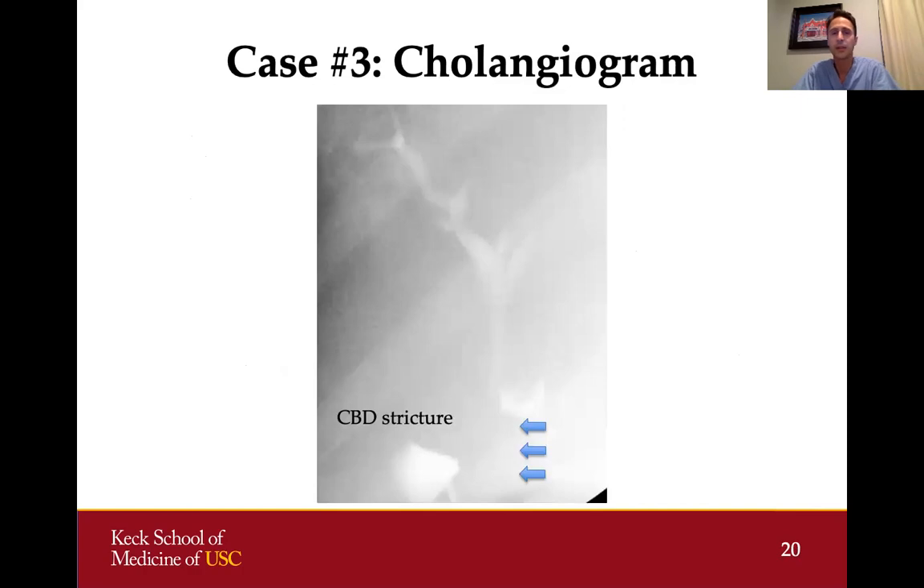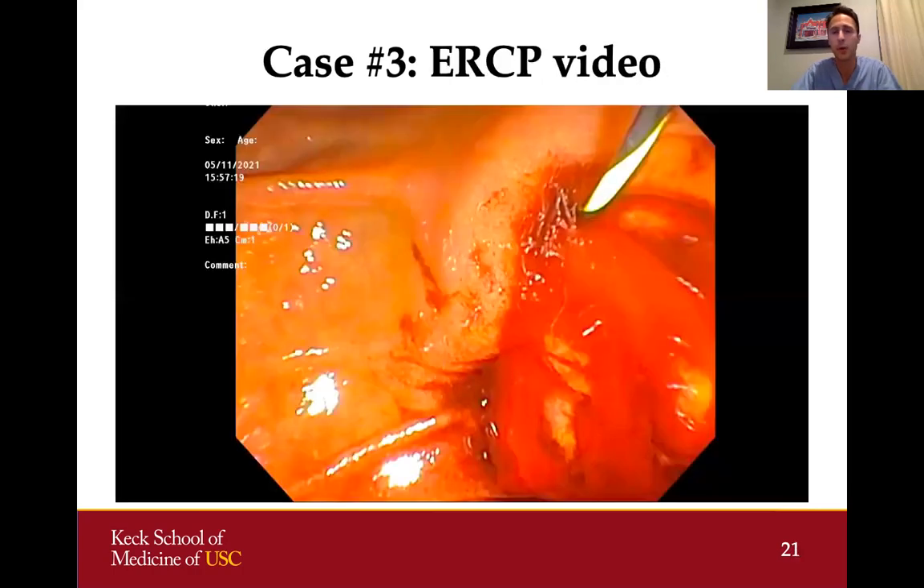On cholangiogram, we can see the common duct and the right and left hepatic ducts. Where the blue arrows point, there is a large filling defect in the distal bile duct representing a stricture of the common bile duct. The decision was made to perform a sphincterotomy so that further stenting and therapy could be performed.